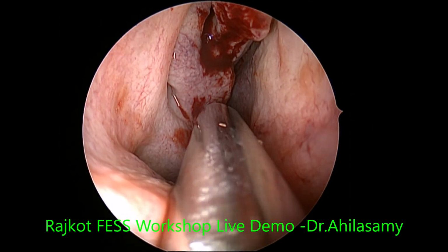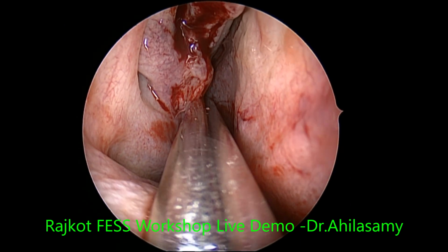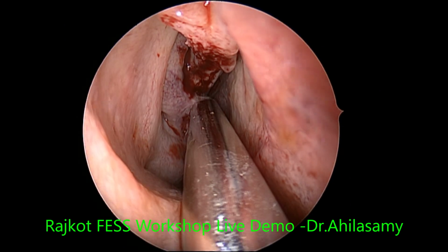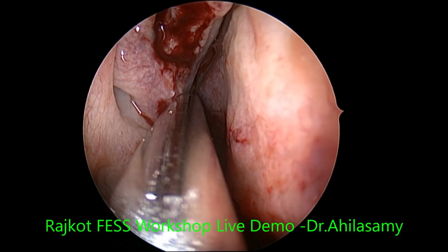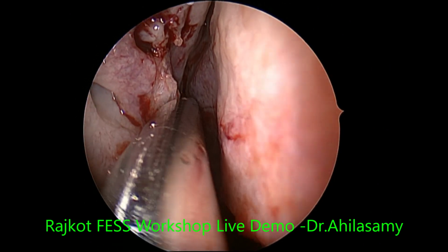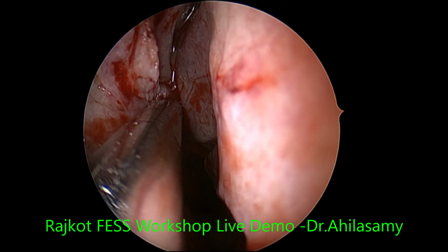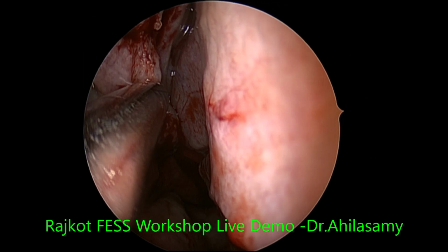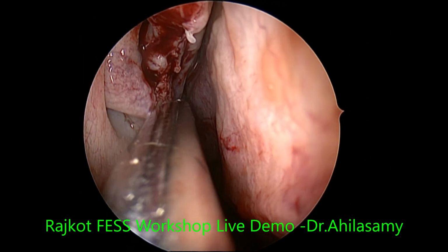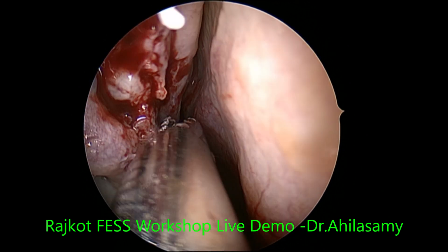Now I am using the straight blade of the shaver system to take out the remnant mucosa of the trimmed middle turbinate, so that we will have a look at the sphenoethmoidal recess area. Now the superior turbinate is coming into the view. This is the middle turbinate mucosa I am shaving off, and behind it is the superior turbinate.